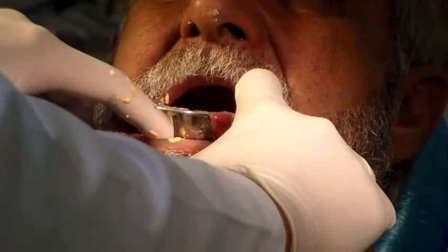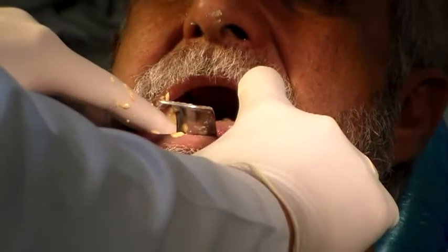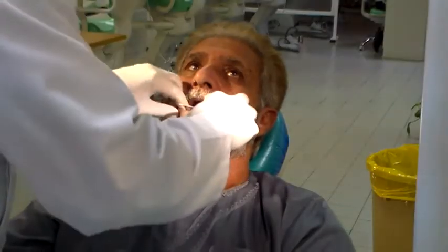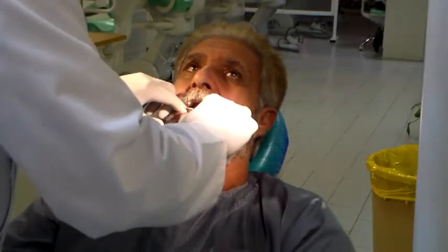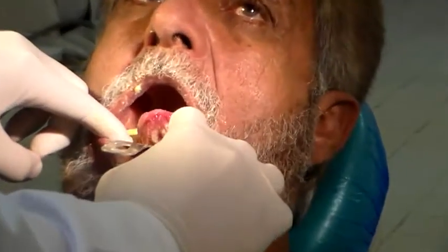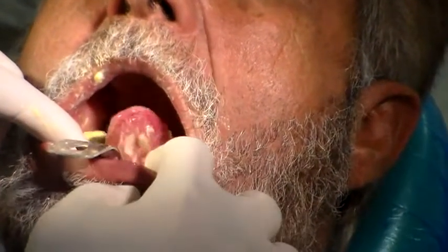Both sides. Turn out. We move the cheeks. Make sure the tongue is out.